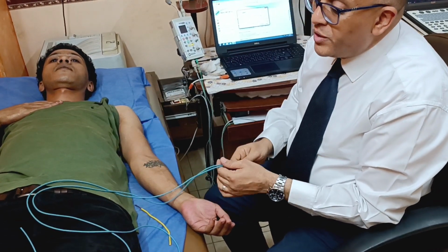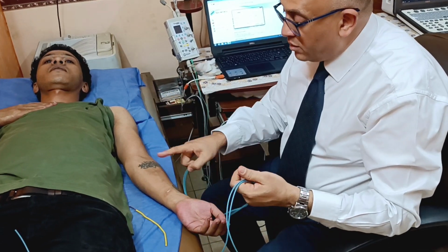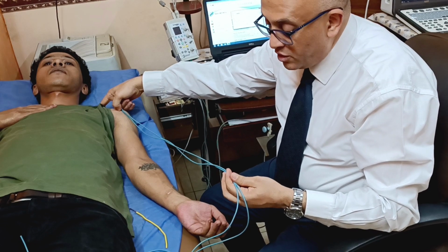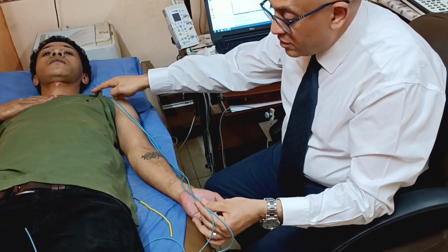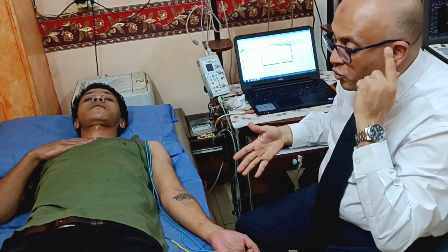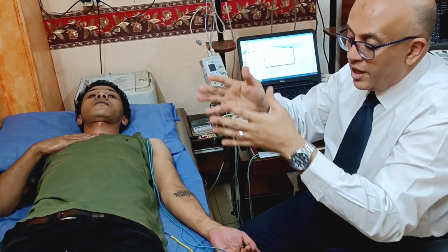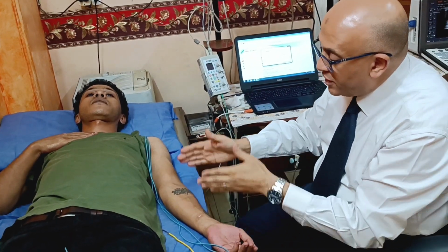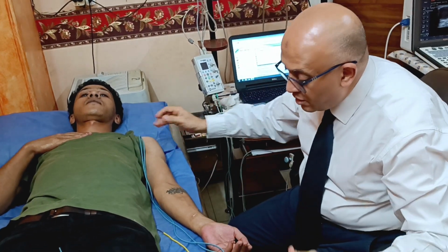So you must get the 1, 2, 3, 4 stimulation. Why? Every site can have a different pathology. So when you get all 4 CMAPs, the 4 conduction studies, the 4 action potentials give an image of the entire length of this nerve.